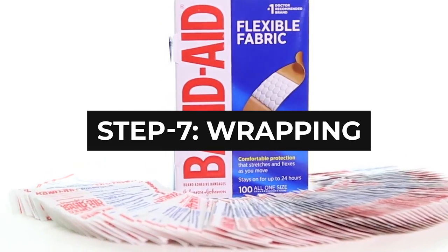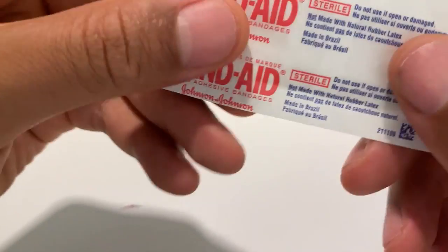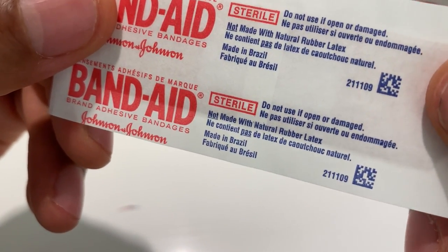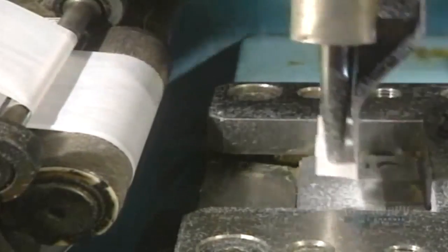Step 7: Wrapping. It is essential to wrap the bandages by applying plastic paper protectors. Once more, a computer-controlled machine comes into play. It wraps the medical plaster one by one and applies unprinted white wrapping paper over the glue-covered ends of the bandage, which protects the bandages. In order to do this, a robotic arm will draw the bandage by suction and place it between two wrapping papers.